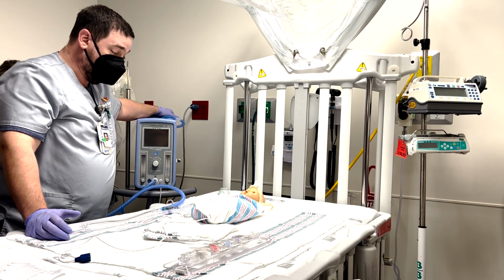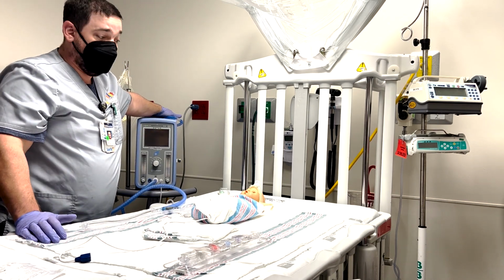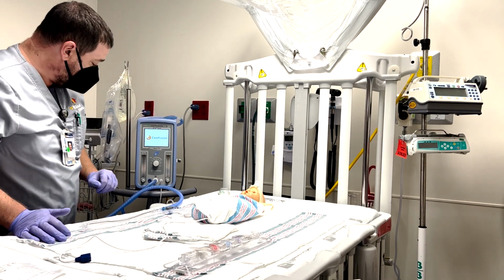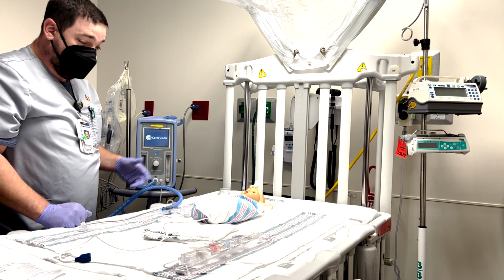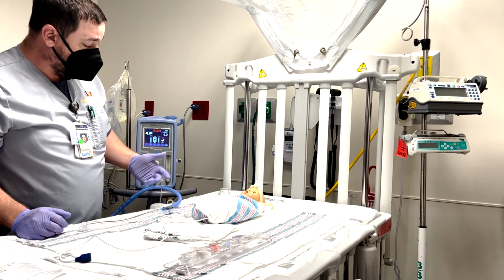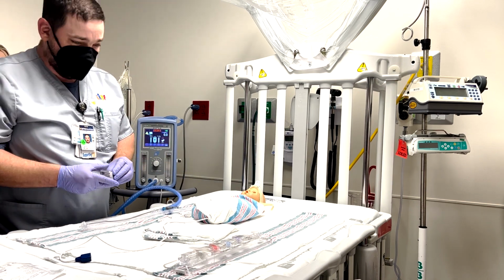Now we go to the machine. You can still be doing this while they're on high flow, making sure that you have two sets of eyes. Turn everything on, and it goes through its self-test. That there, not to worry about. It's its own self-test. So what I have to do is pick a set of prongs or a mask. In this case, I'm going to pick a mask. It's hard to get the prongs in the baby at this point.